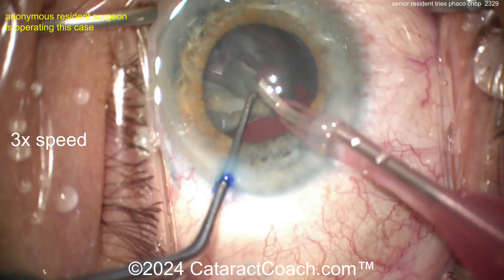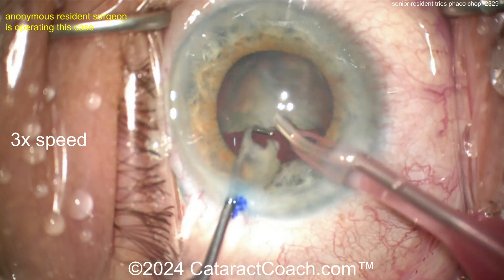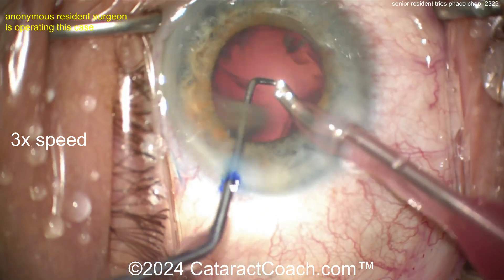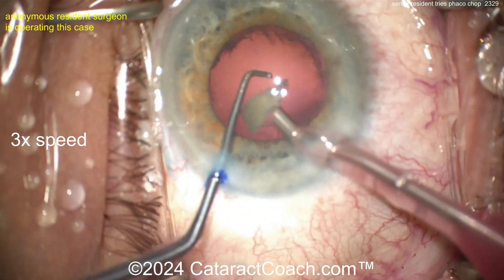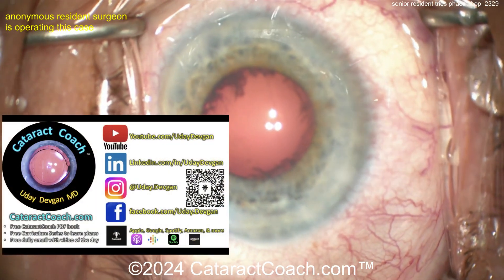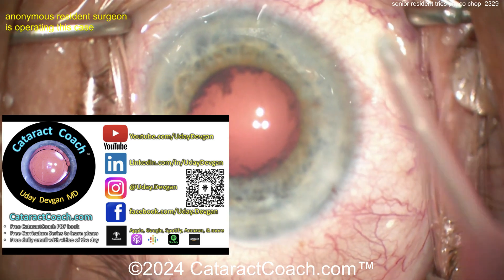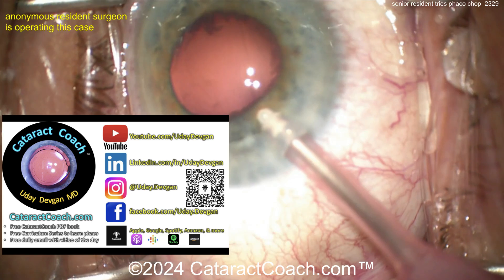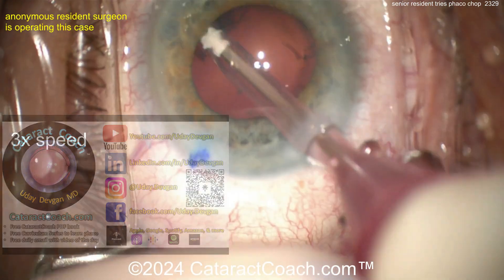We're keeping the videos anonymous so there's no incentive for the resident to boast — but this is fantastic. I'm guessing at least 200 cases in and 30 to 50 chop cases. Check out CataractCoach.com — there's a free PDF book about learning cataract surgery, a 25-part curriculum, and videos on exactly how to perform faco chop.